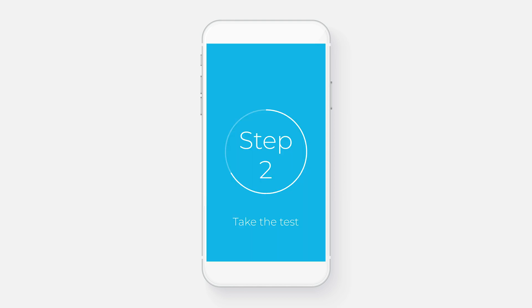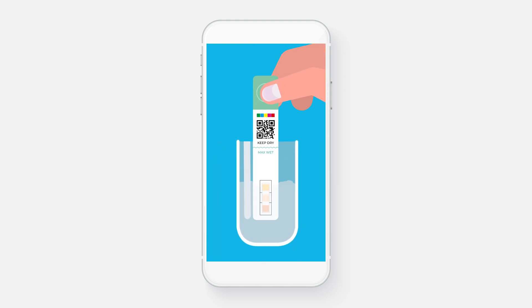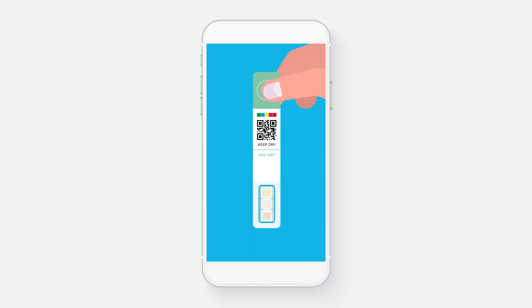Step 2. Now you're ready to take the test. Try to collect your sample from the middle of your urine stream and dip the test strip briefly into your sample. The squares need to be wet, but make sure it doesn't get wet above the line. Then let the app countdown timer tell you when it's ready to scan.